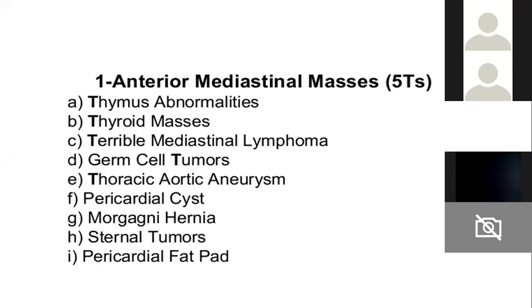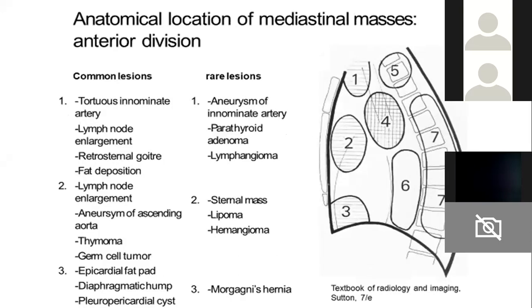So individual lesions, we'll try and keep as case presentations. We will not go too much into depth, otherwise we'll not be able to cover it in this session, or you can do it as a self-study, that's better. Okay, so we'll try to understand how to approach a lesion in this class.